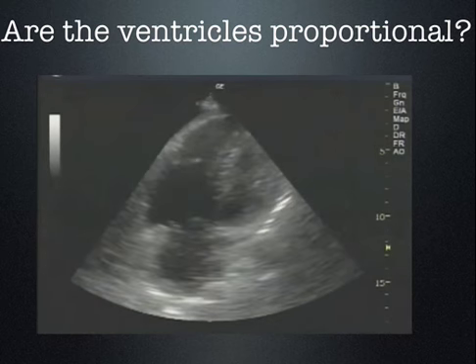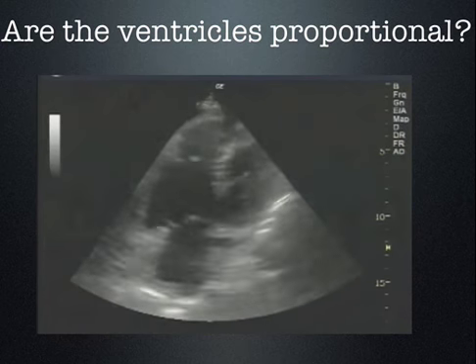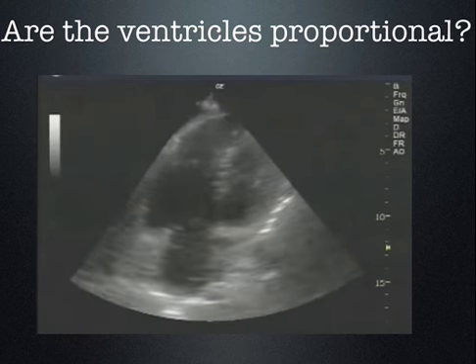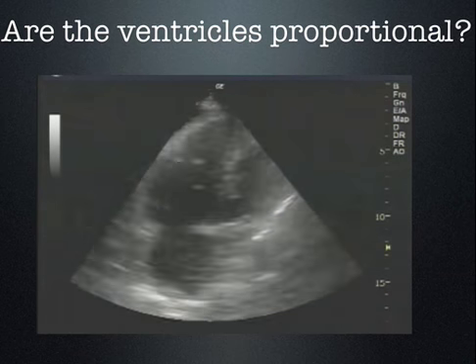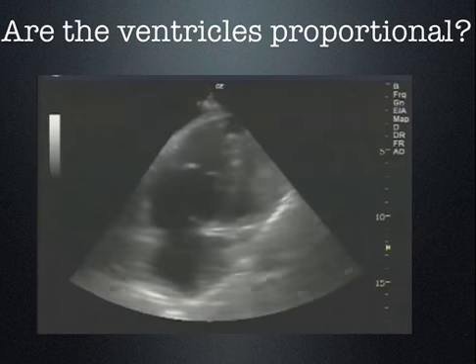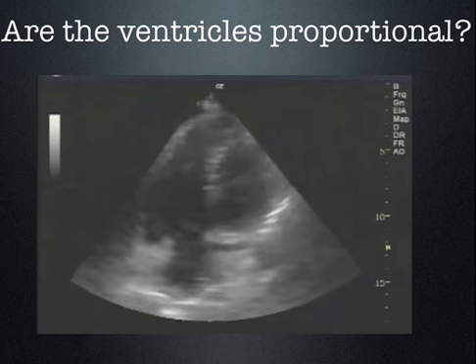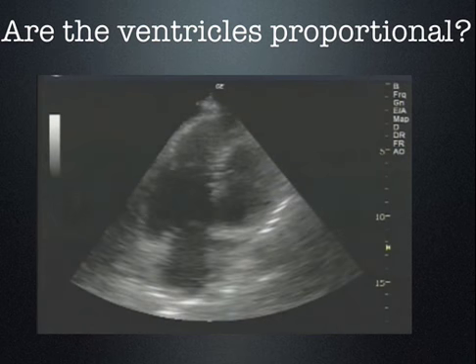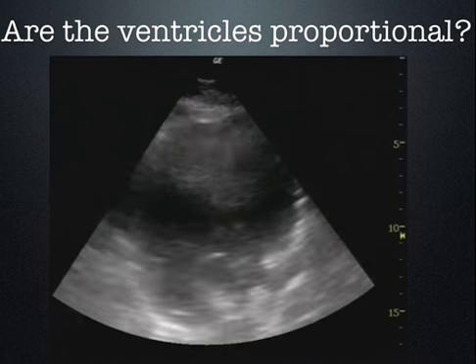Right ventricle, left ventricle. This patient just came from a cross-country trip and got out of the car and had sudden onset of shortness of breath and chest pain. The pain's in their chest and in their back. Probably a PE, but they're saying it's really in my back too. It could be a dissection. I'm getting really uncomfortable. I really want to lyse this person. I feel really good about it if I see this on there. Okay? This one's tough.